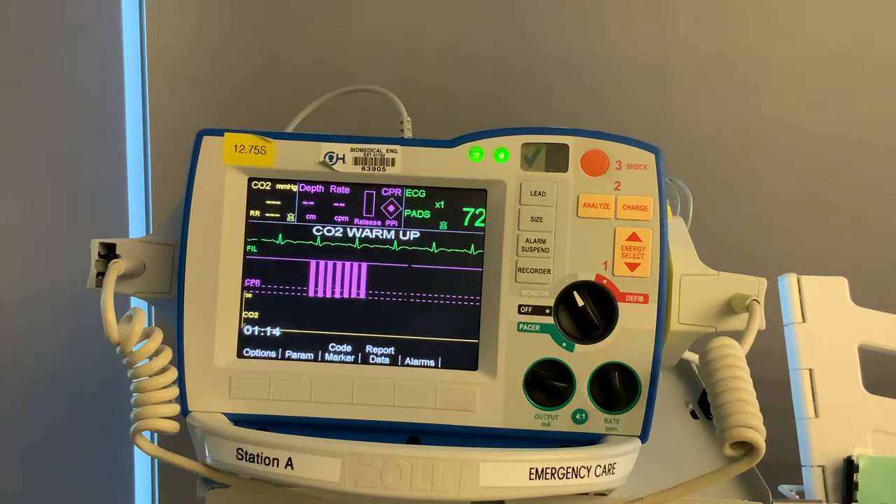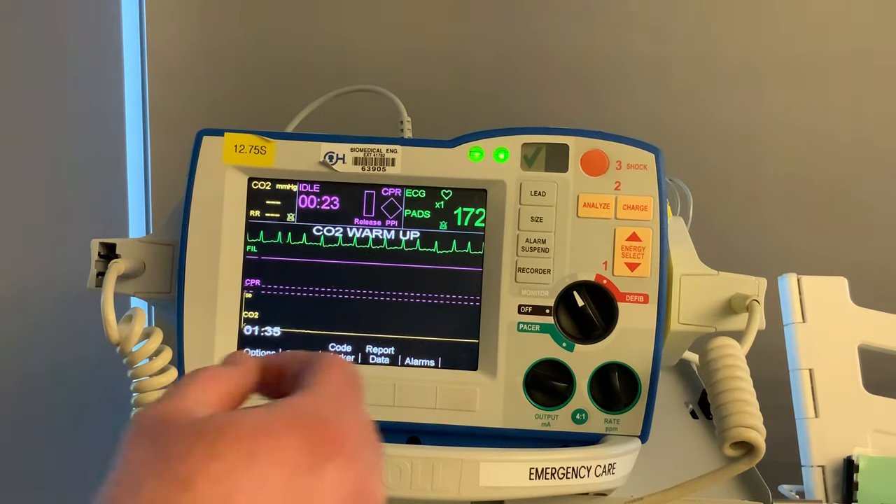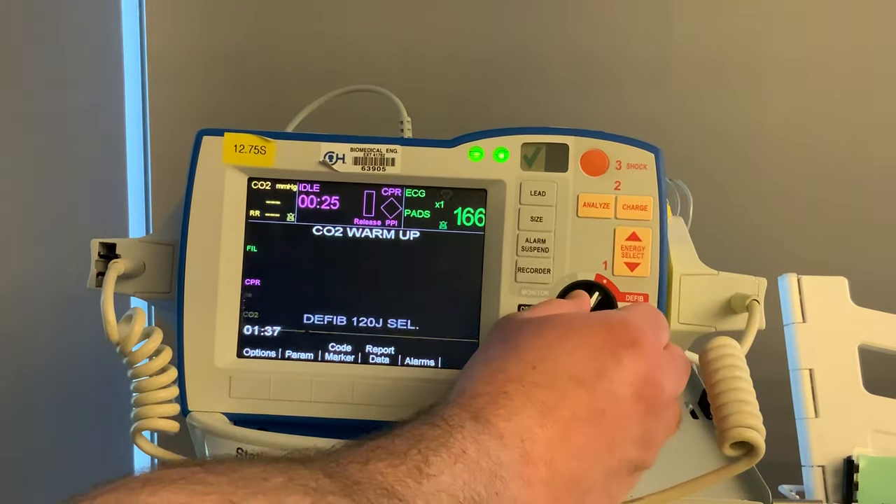Now we're going to go over some steps for cardioversion and defibrillating with this defibrillator. We're going to have another rhythm pop up on the screen. Looking at this rhythm, we're going to call this SVT. For SVT, if you have a patient who is unstable, your thought process is synchronized cardioversion. Since we're going to do therapy, we're going to turn it over into defib.